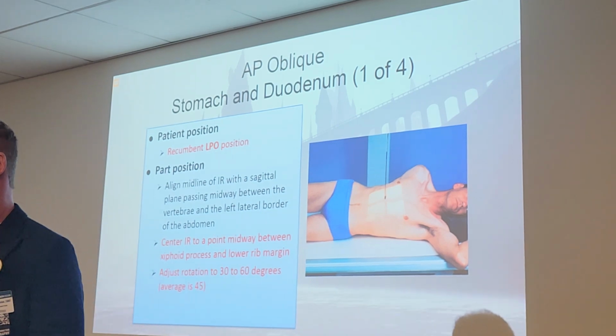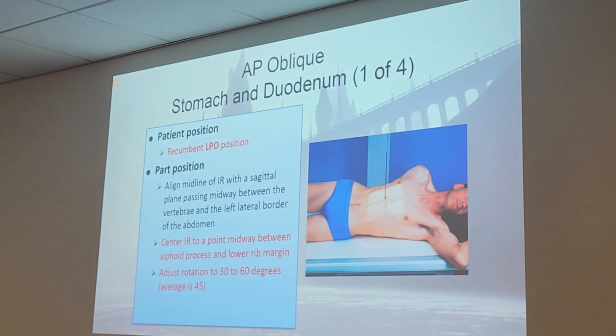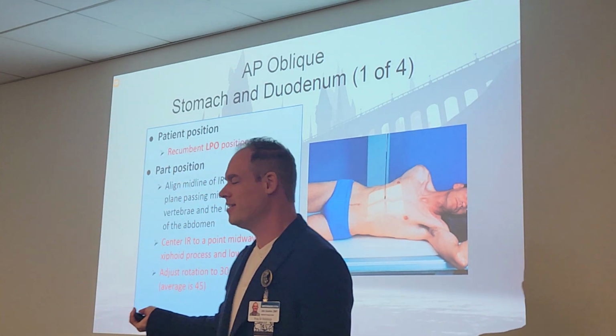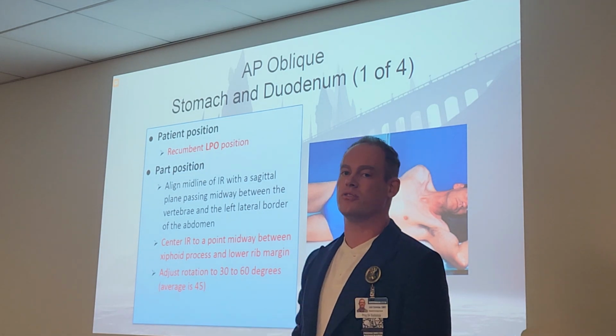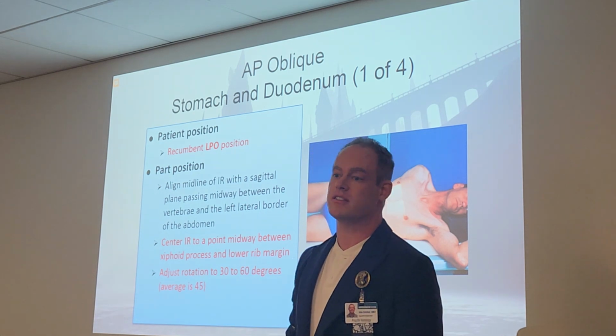Lower ribs, yes. Similar to ribs. Lower rib margin and xiphoid process in between both is where we're centering. And it's being kind of mean again, a different obliquity than the RPO. Now it's a 30 to 60 degree obliquity. The average is 45, but you have the range of 30 to 60.